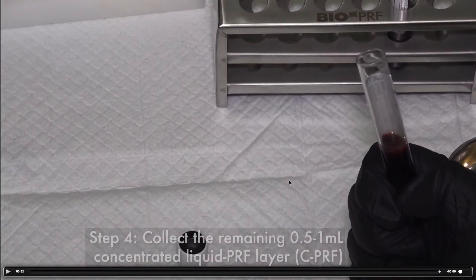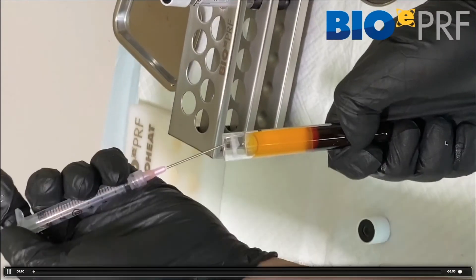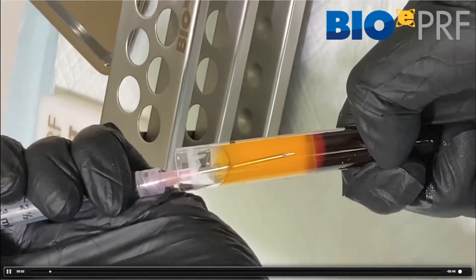And again, as we reviewed, there could be a little bit of red blood cells that are incorporated in there and there's no issue with that.